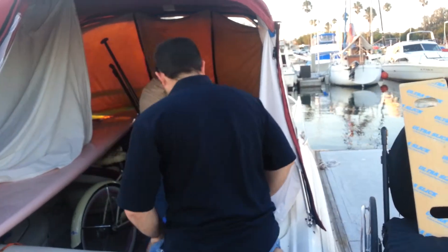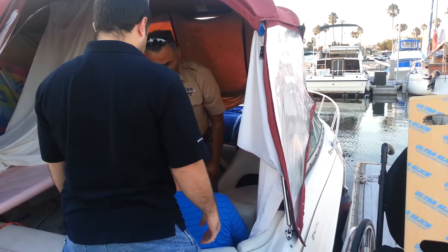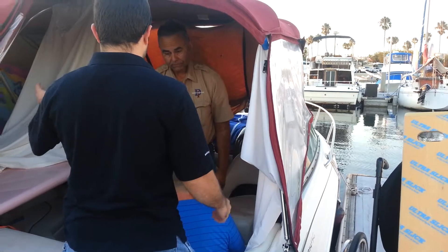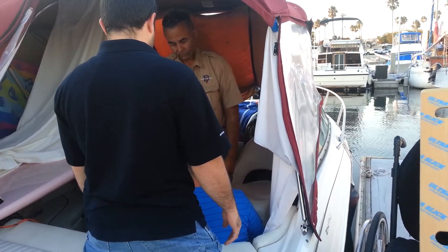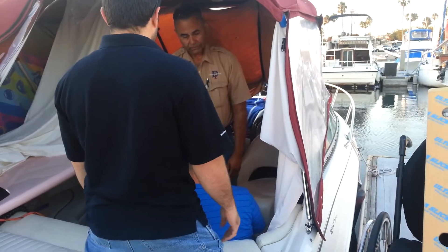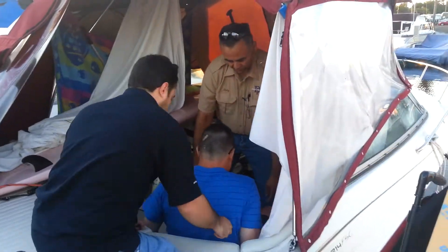So with the Hoyer mounted here, he would be here and it would actually be over there. Then lift it up and put them in the chair directly. I would slide over a little bit, put the sling on, and that would be it — up and around and back in the chair. Then I just lean forward and I'm out.